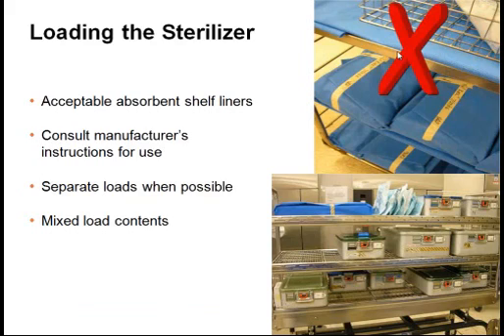It is preferred to sterilize textiles separate from hard goods. However, if this is not possible, place textiles on the top shelf and hard goods below to avoid condensation running off, which could moisten the items below. Instrument trays should be placed flat on the shelf to maintain instrument distribution and to facilitate drainage. Basin sets should be placed on their edge, tilted for drainage.